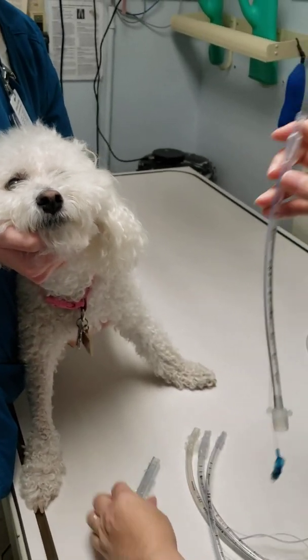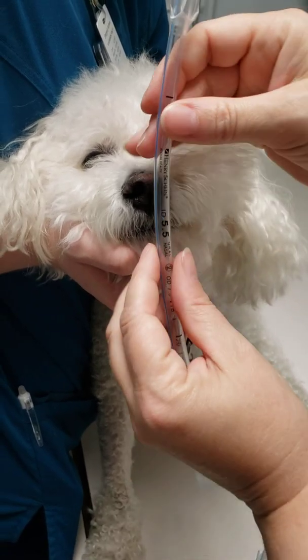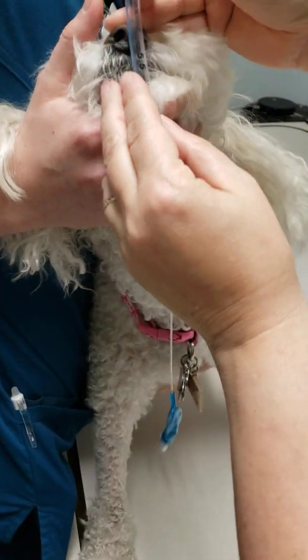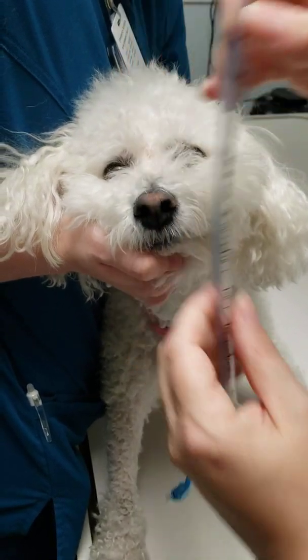The other way that you can tell, besides checking the diameter of the nares, is the distance between the nares. You can see that that one fits in between.